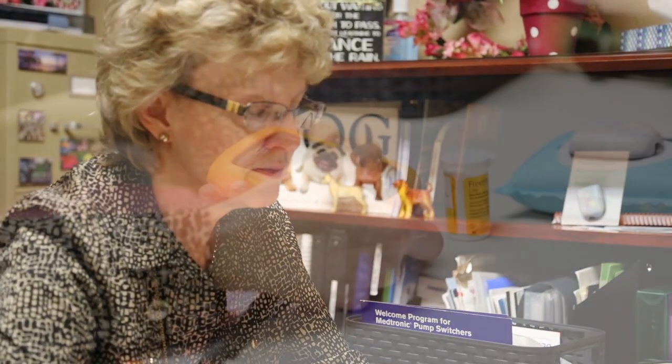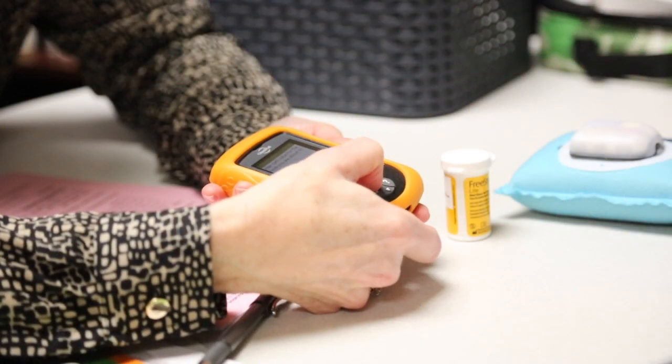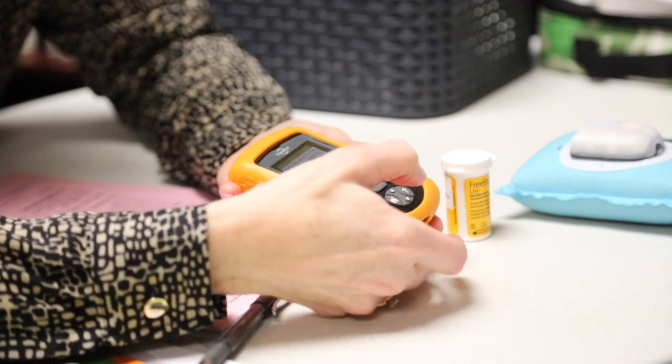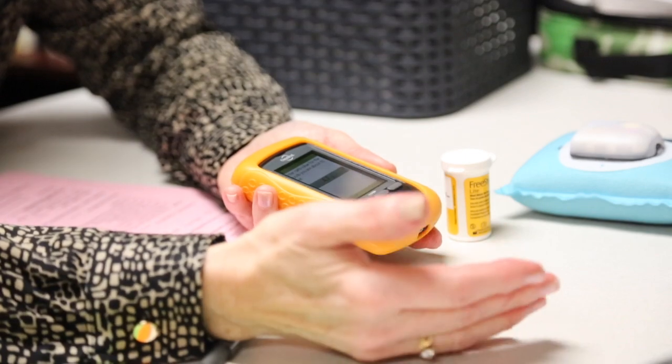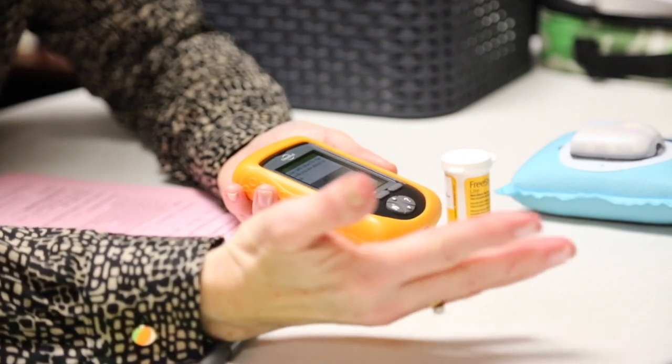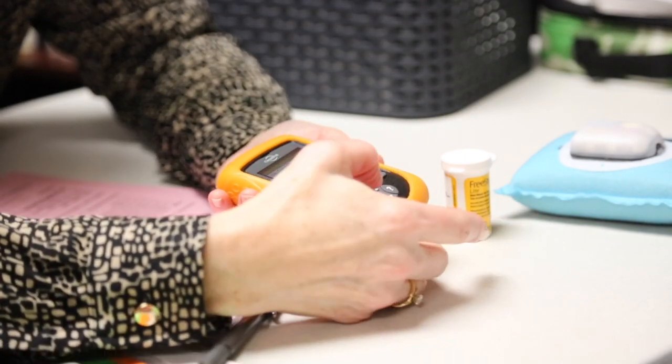Yeah. At this age, a lot of kids will tell me, once they get on a pump, I feel more normal. It's a great thing. Absolutely. This would be on your body. You would be using this. It looks like you're using a cell phone to give yourself insulin.